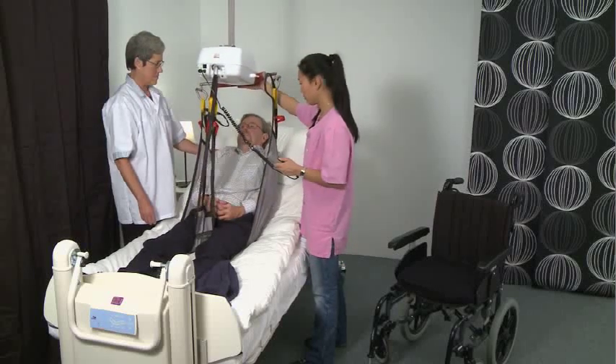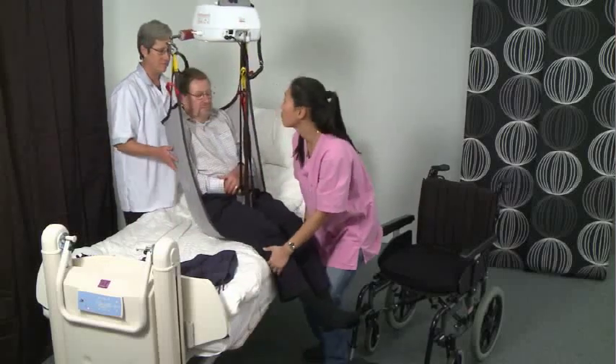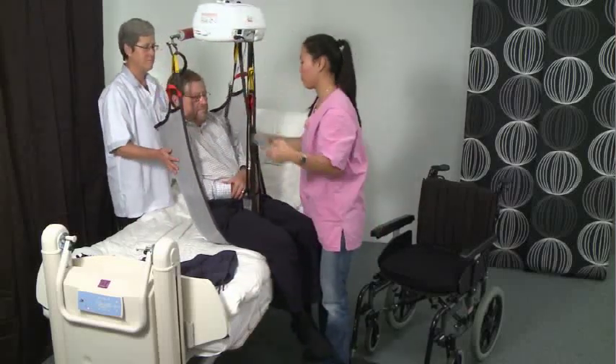Continue to lift, making sure not to raise the client higher than is needed. Rather lower the bed if necessary. Place a steadying and reassuring hand on the client during transfer.